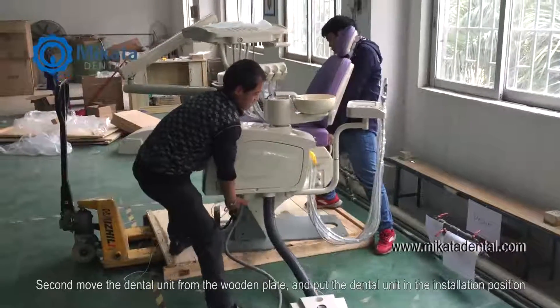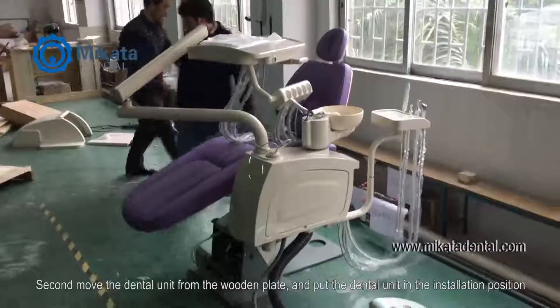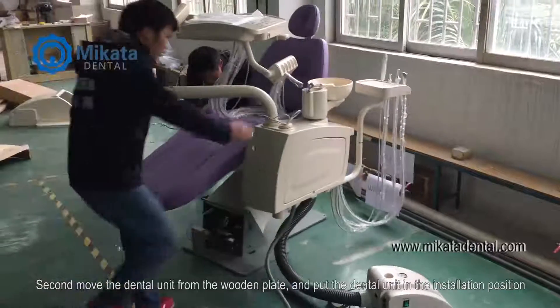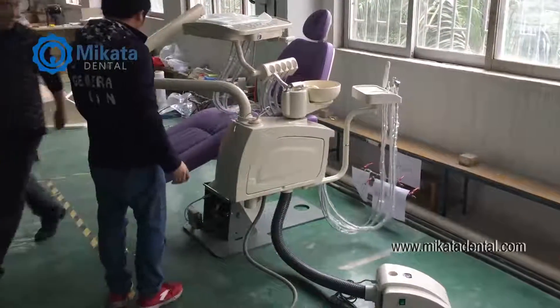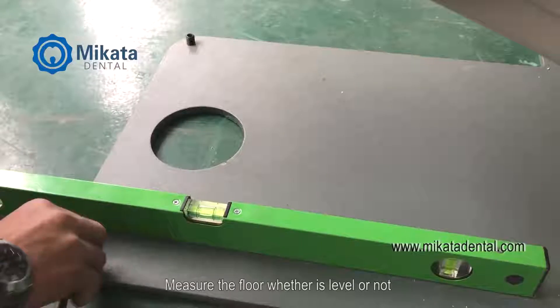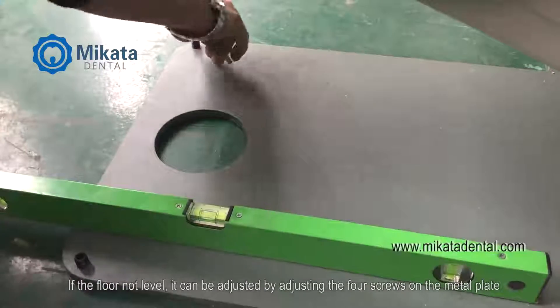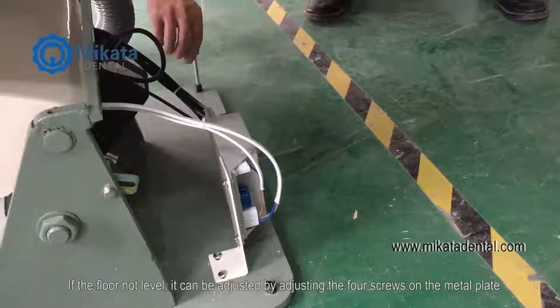Second, move the dental unit from the wooden plate and put the dental unit in the installation position. Measure the floor to check whether it is level or not. If the floor is not level, it can be adjusted by adjusting the four screws on the metal plate.